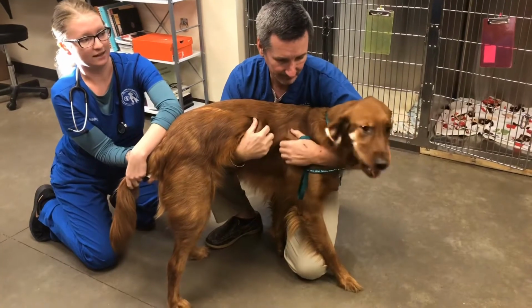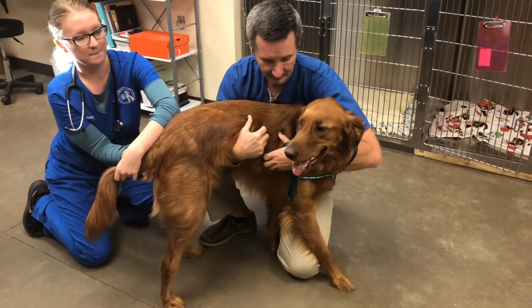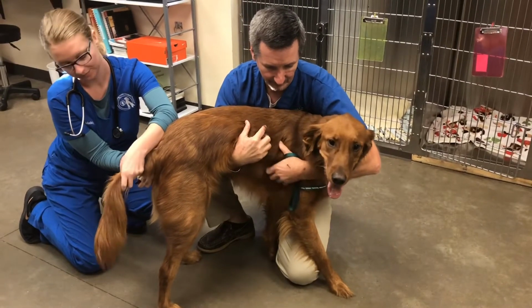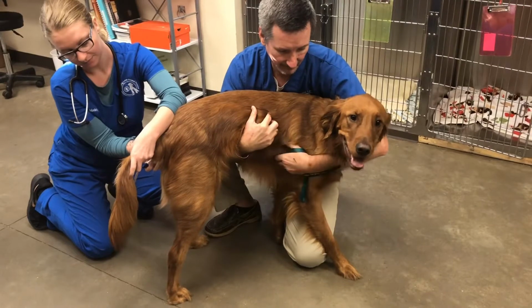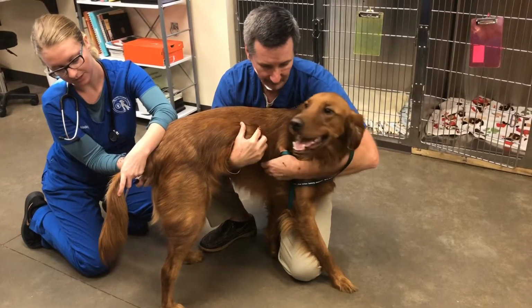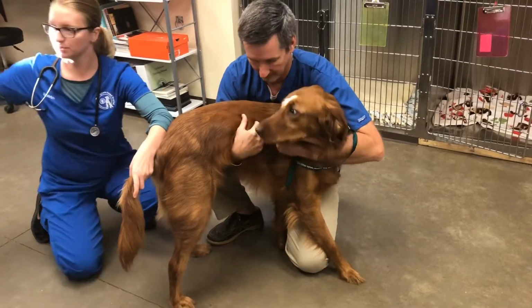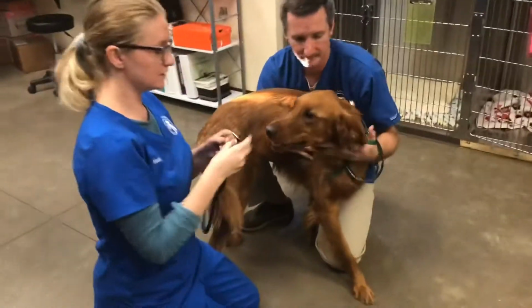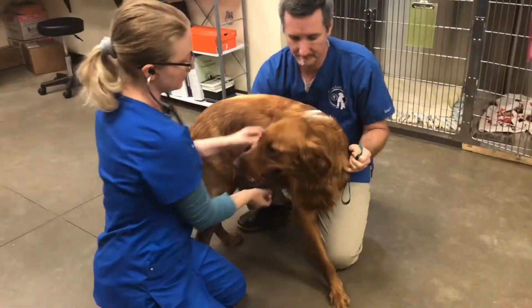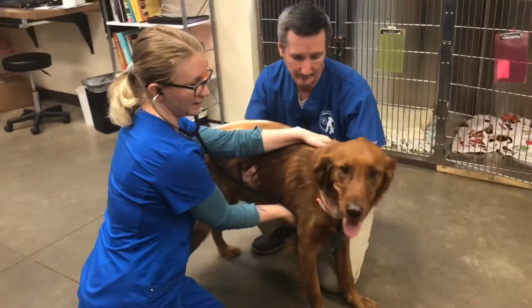Anything between 99 and 102 is usually a normal temperature for a canine. And his temperature is 101.1, which is normal. And then we'll move to his pulse and we'll take a listen to his heart. You want to listen near the axilla area.